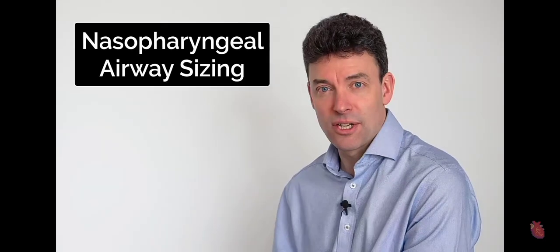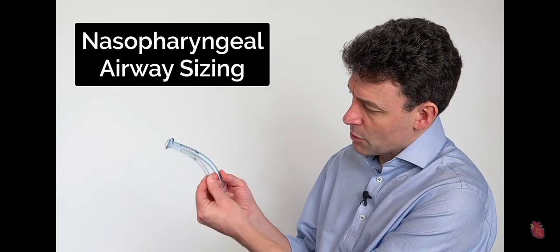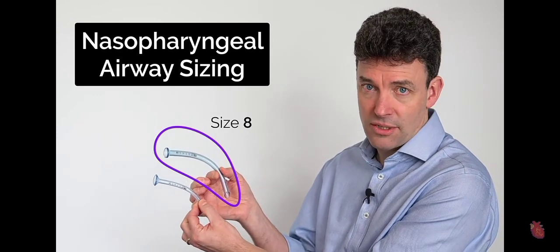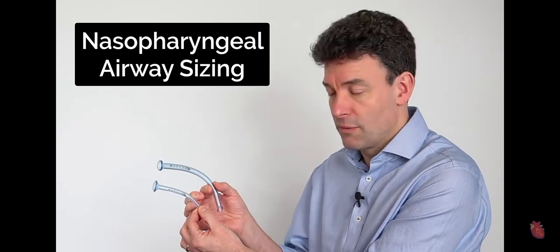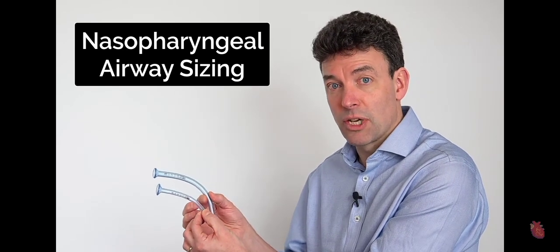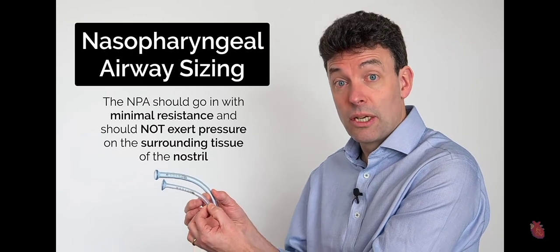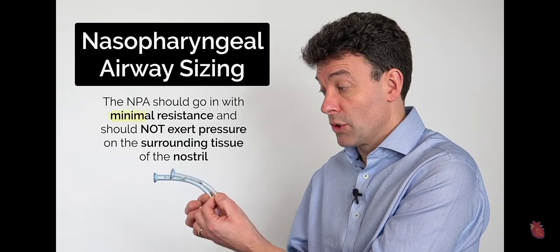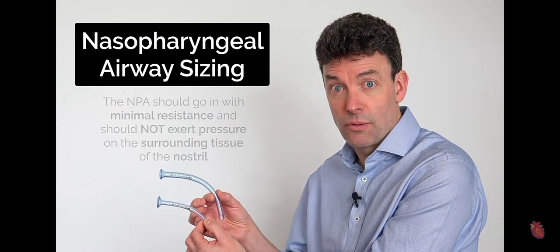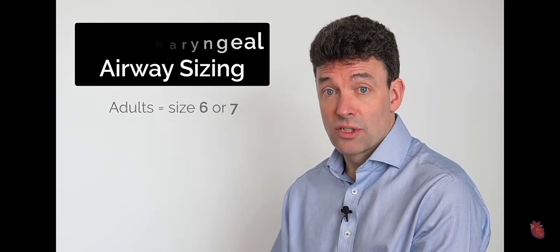There are several different sizes of nasopharyngeal tubes. For example, here are two. This one, slightly smaller, is a size 6, and this one is a size 8. There's no reliable way of sizing the right tube for the right patient, but it's a matter of looking at the patient's nostril and seeing which size you're likely to get in. In general, you want to make sure that the tube goes in easily without causing extra pressure around the skin of the nostril. Most adults will be fine with a size 6 or a size 7.